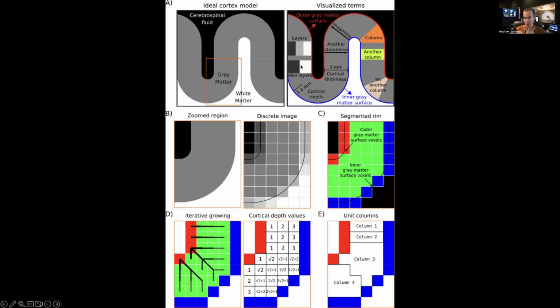This is one of the options of the user. And you can make it more than 6 layers if you want. There's really no restriction on it. I mean, if you don't have great high resolution, like let's say you have 0.3 millimeters as opposed to 0.1, you might not want to use that many layers. We'll see some of the differences later on.